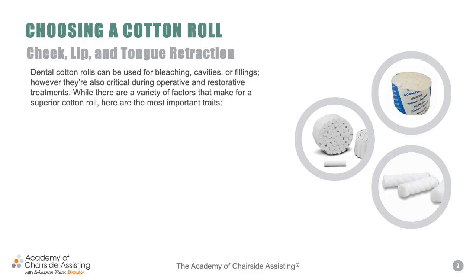The first thing I want to talk to you about is probably one of the number one things that we will get to know and utilize every day on a daily basis: cotton rolls, helping us to make sure that we are keeping the saliva glands as dry as we possibly can. These cotton rolls are basically an item that we would place underneath the patient's tongue, in between the cheek, and utilize for isolation during so many different procedures, from sealants to cementation, to any type of indirect restoration preparations. These are just something that you're going to see from the very first day you become a dental assistant.